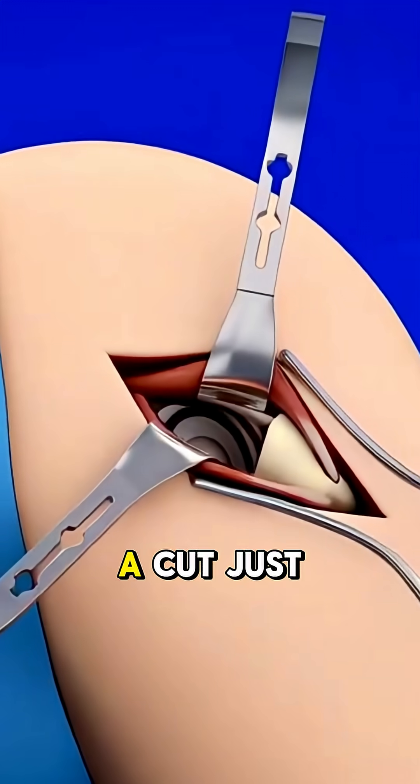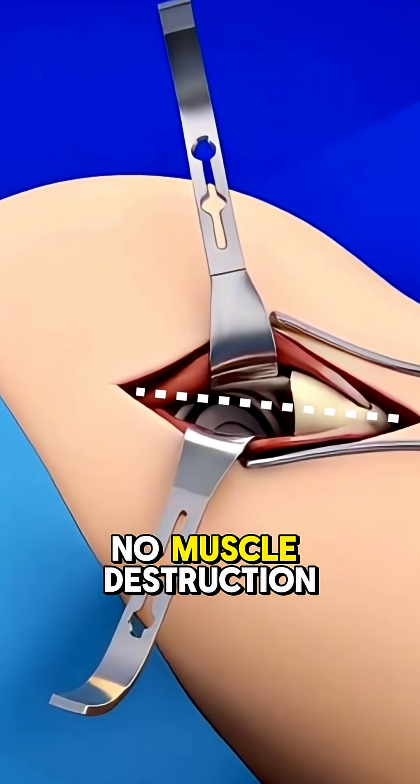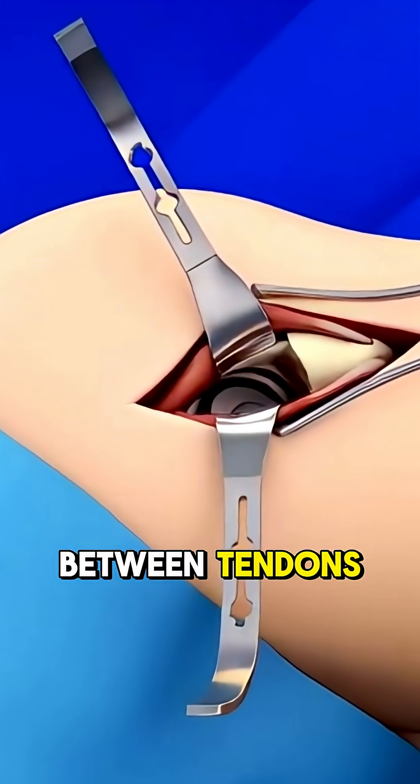The surgeon makes a cut just 2-3 cm long — no big incisions, no muscle destruction. Just careful navigation between tendons and muscle fibers.